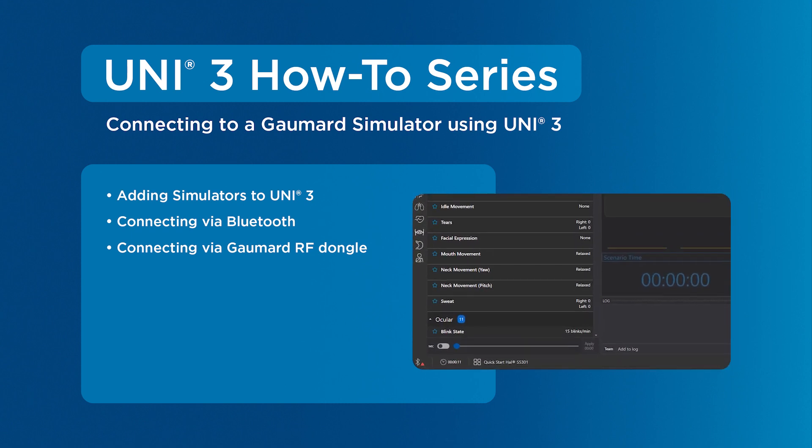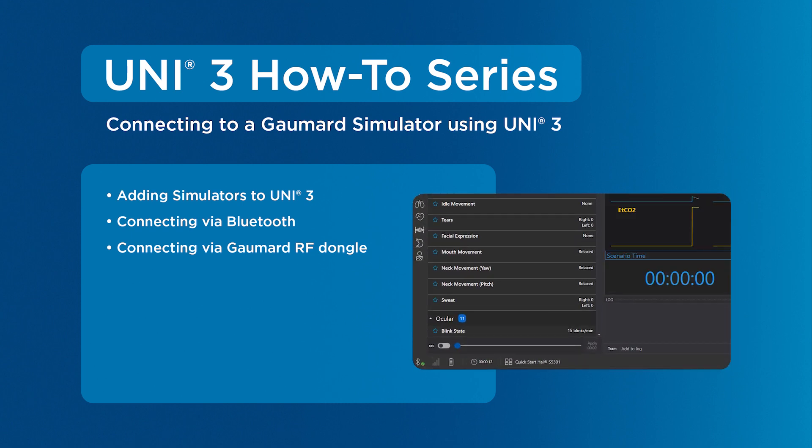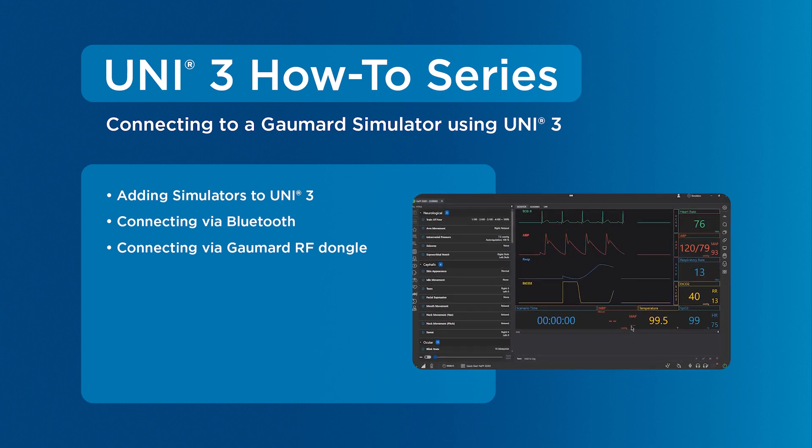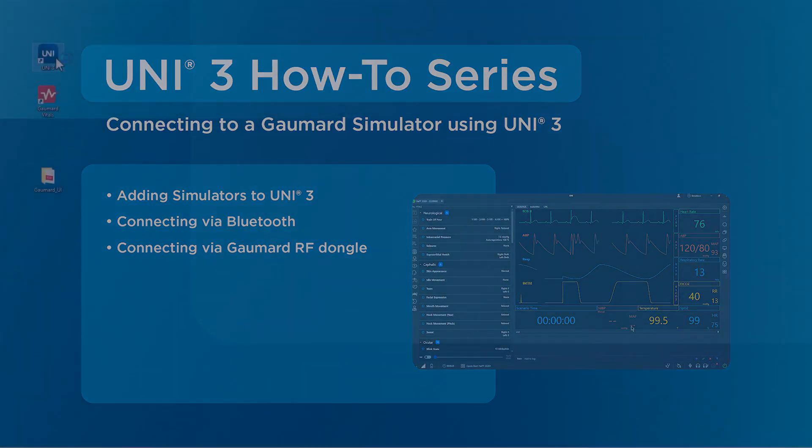Then, we will cover the steps to connect Bluetooth-capable simulators via Bluetooth. Last, we will cover connecting via a GoMard RF dongle.